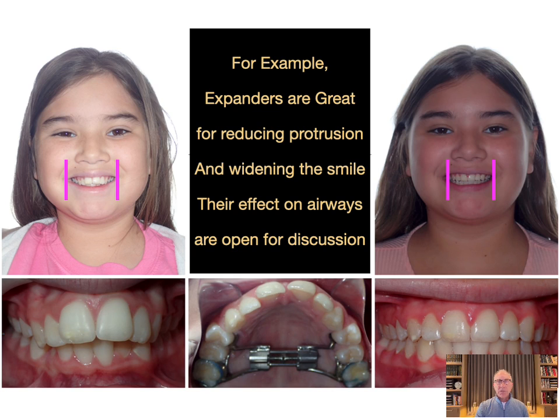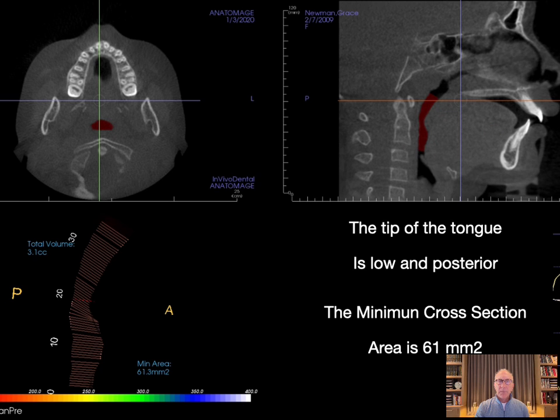With that, I introduce our first patient without a crossbite, but a narrow upper jaw. This patient was a thumbsucker, which contributed to the malocclusion and was edge-to-edge class 2. An RPE was used with full orthodontic appliances to widen, get corresponding mandibular growth, and finish in a class 1 occlusion. At initial presentation, the tip of the tongue is low and posterior.